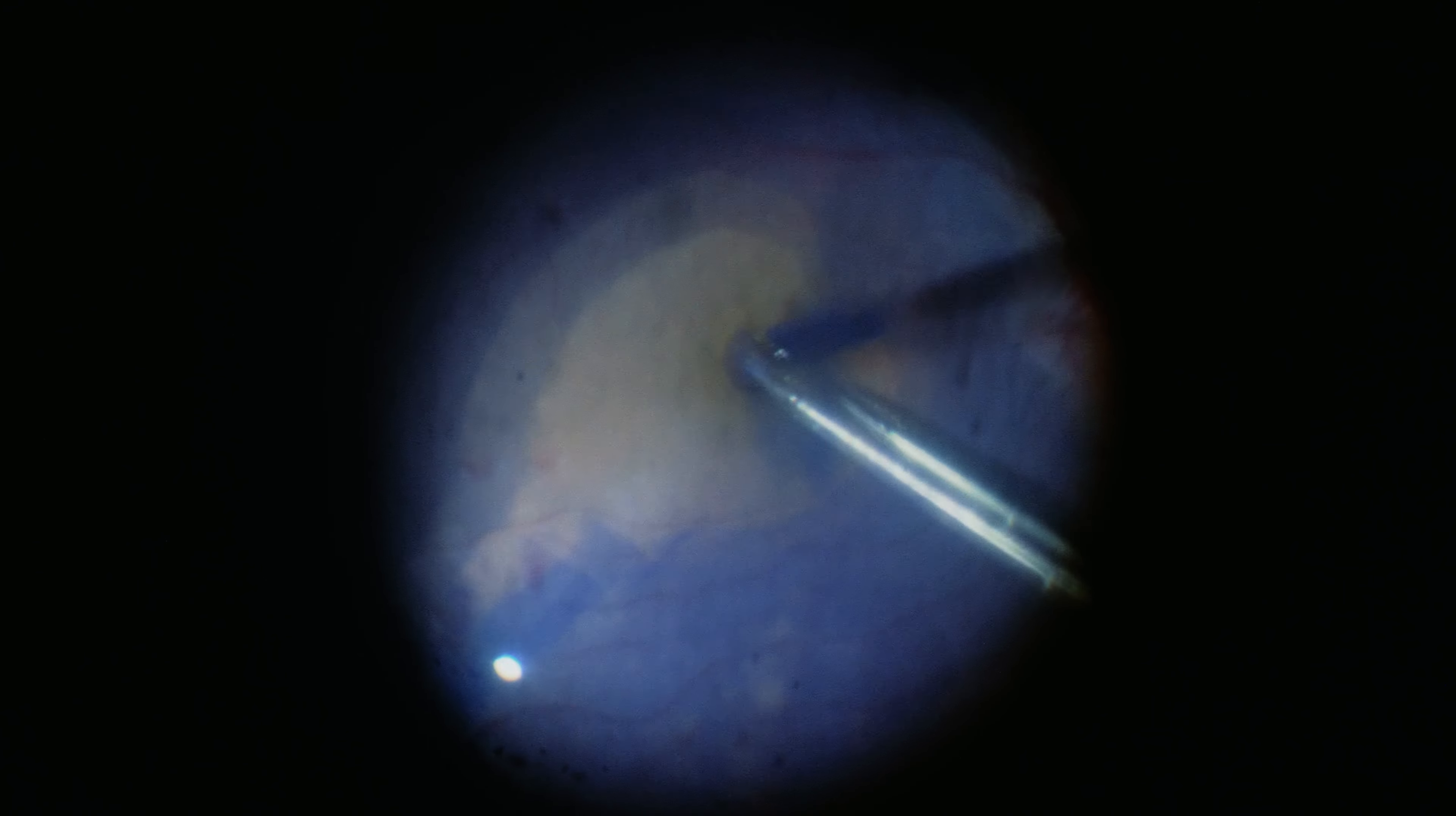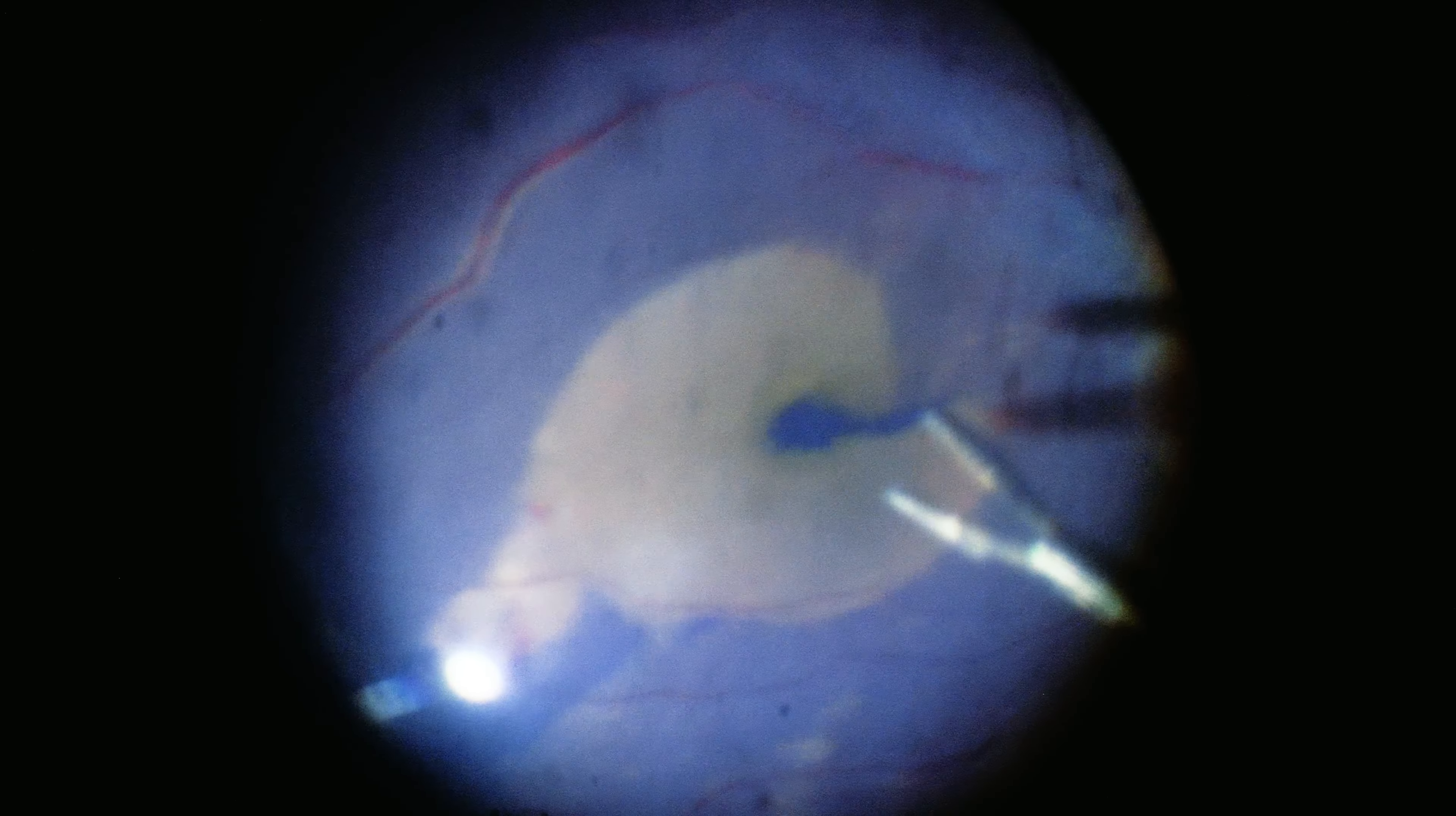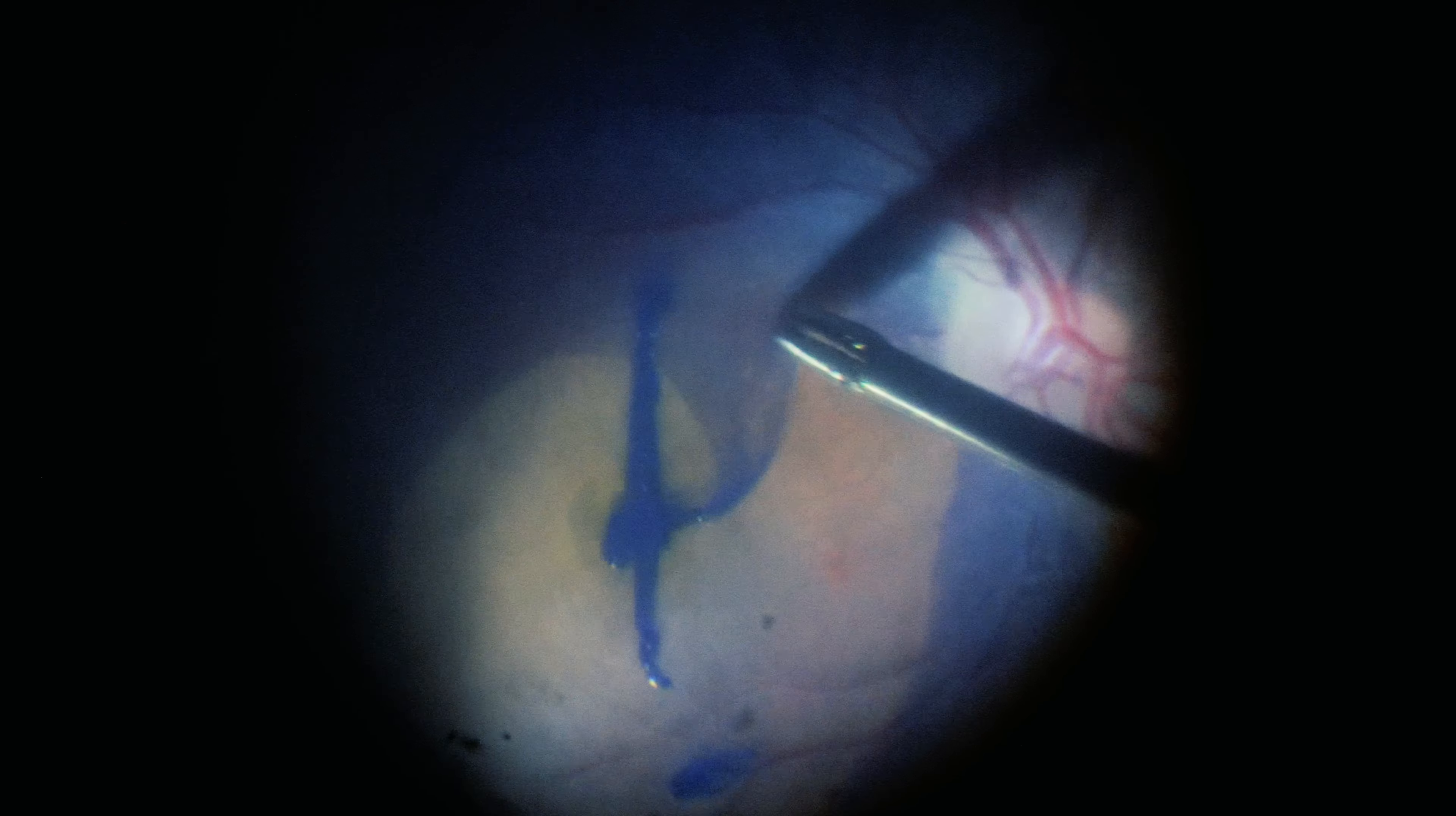Creating a good and more focused visualization and stable surface, making it a lot easier to grab on the ILM tissue with more controlled movements and creating a force downstream towards the hole, the target for inserting the ILM once again. Another good point to consider was to stabilize the membrane down by leaving a stalk directly attached to the membrane stuffed inside the hole. In this way, creating another force aimed at avoiding inadvertent escape of the membrane from the hole.